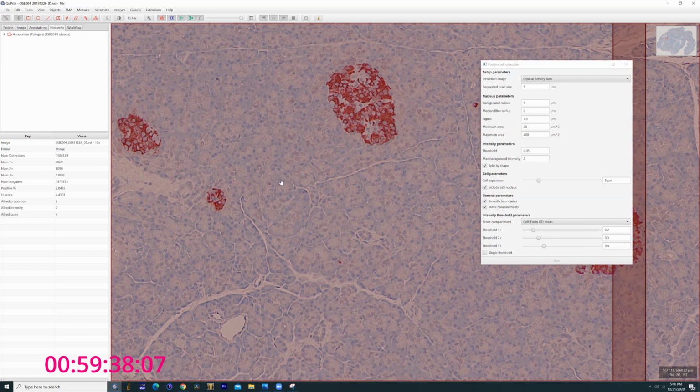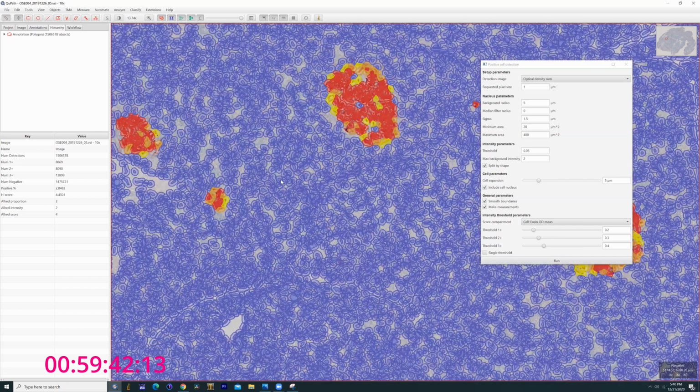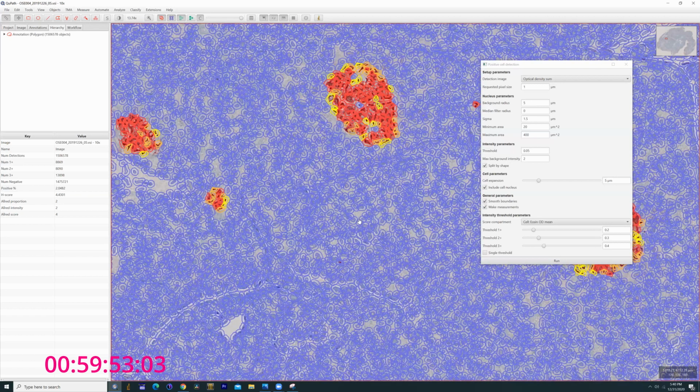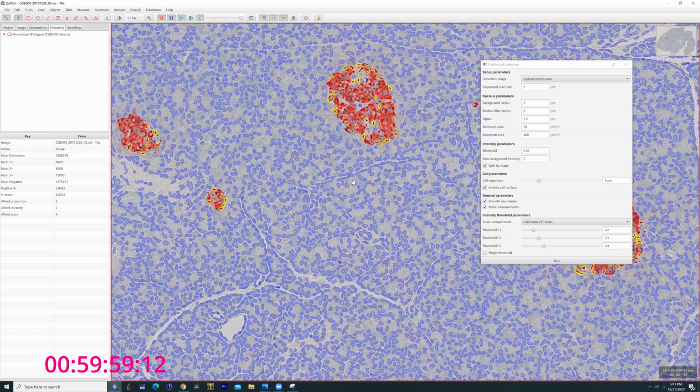It's almost there. Okay, there we go. So my nucleus is back in. It looks a little busier than before, and that's the difference. Here, let's get rid of the fill. Just go down to the nuclei again. So right click on your mouse, hit nuclei only.